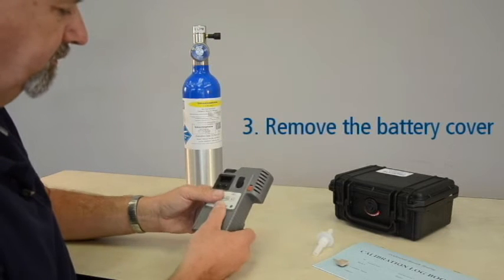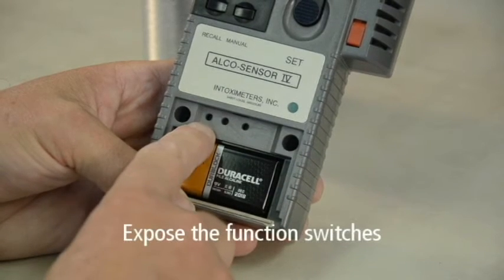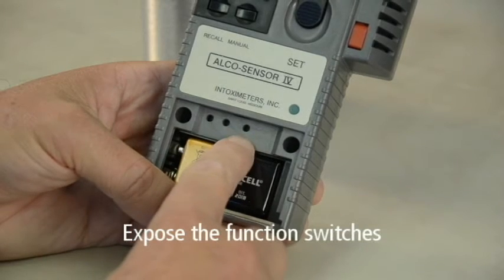Next, remove the battery cover located on the front of the device to expose the function switches, and if necessary, remove any security tape covering the holes.